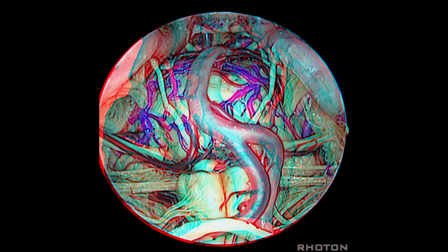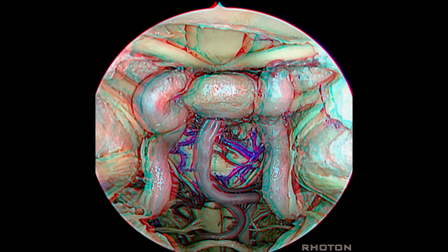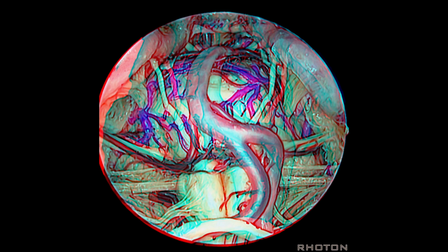This is the view that you get transorally looking upward, but with the transnasal approach, all of this anatomy is straight ahead, down to C2, all the way up to the planum. Transoral view, but it's hard to work upward from the oral cavity with a 45-degree endoscope. But the areas that can be approached with the endoscope.